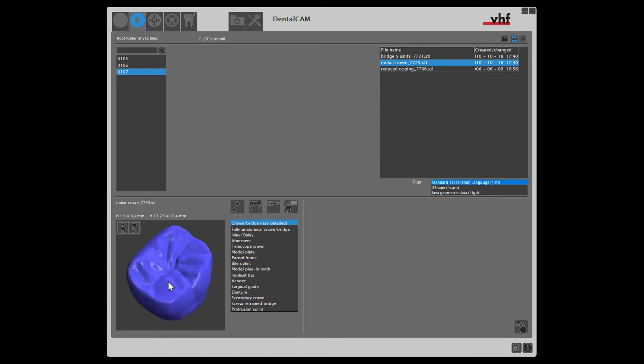Now we must specify the calculation options. First, we select the indication from the list. In our case, the object is a fully anatomical crown.